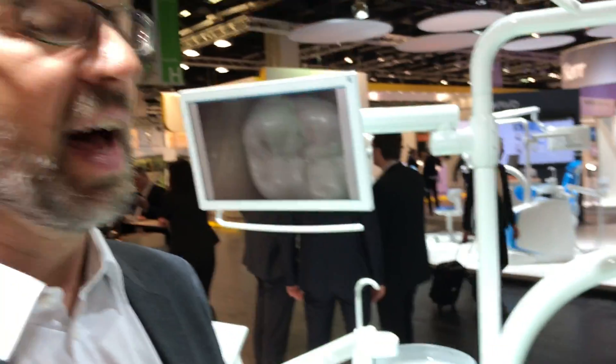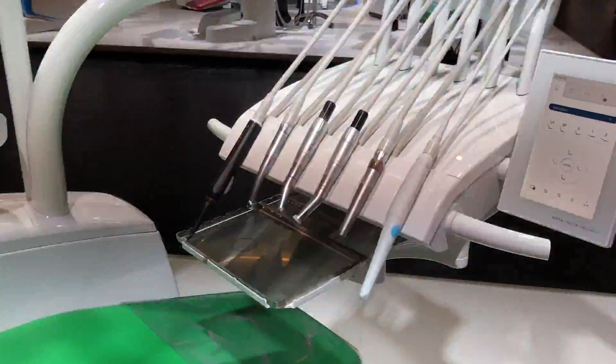Hello, my name is Jörg Eberle. I'm product manager from Kivo Dental and I'm responsible for treatment units. Today I want to show you the hygiene functions of the Aesthetica E70 vision.